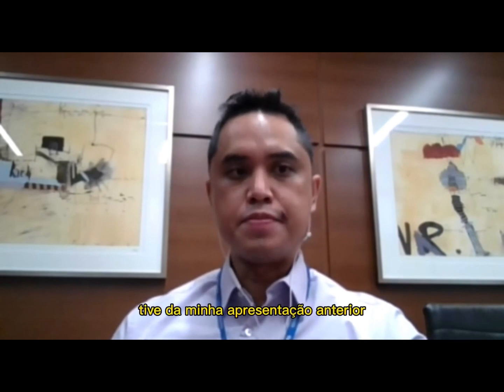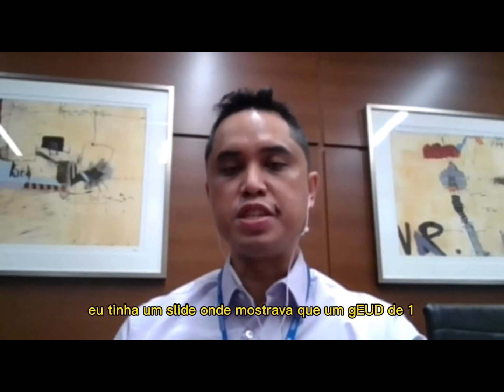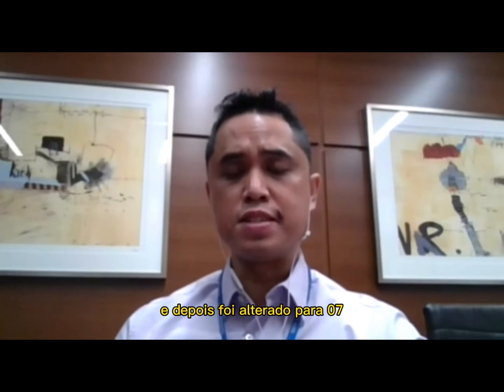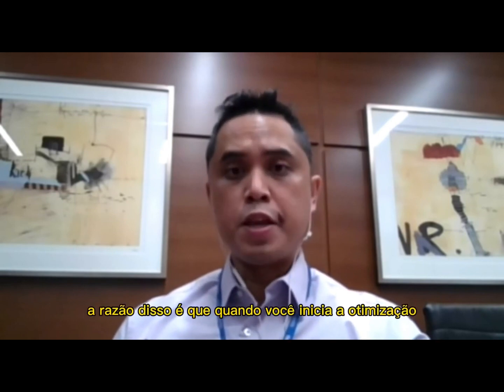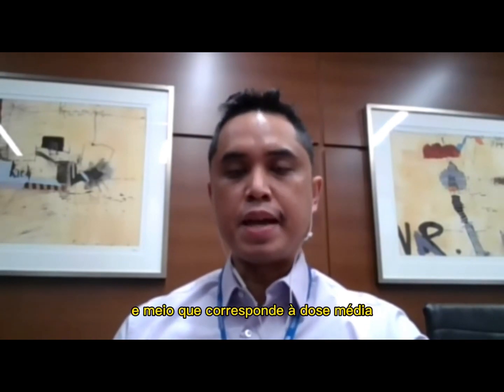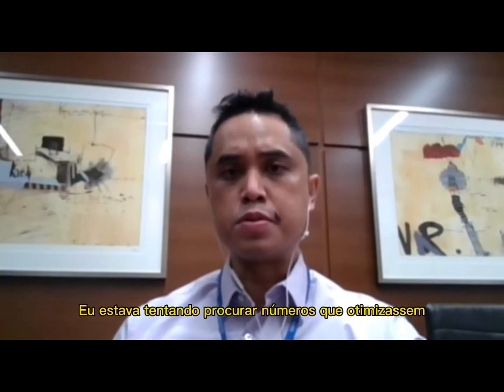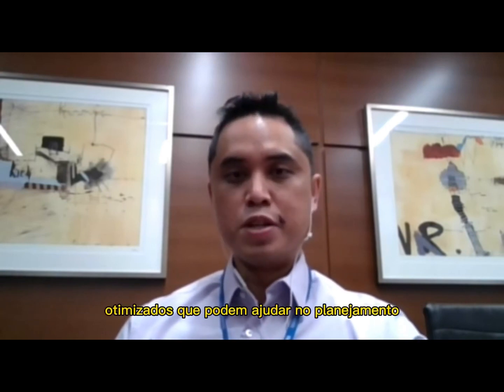On slide 18, from my prior presentation, I had a slide where it showed a GEUD of 1 in the parotids, and then it was changed to 0.7. The reason is that when you start optimization with a GEUD of 1, it defaults to that, and it kind of matches with the mean dose. So you're not really challenging the system. I was trying to look for numbers that optimized, which can help with the planning.